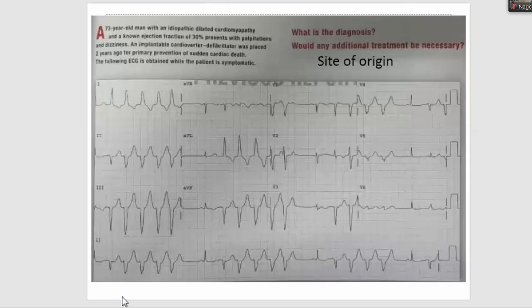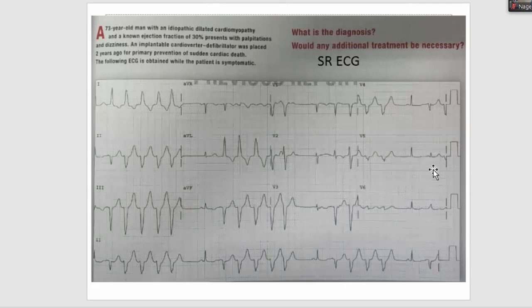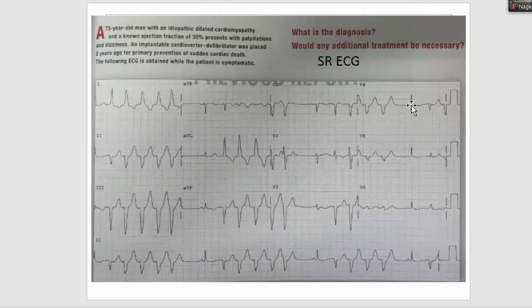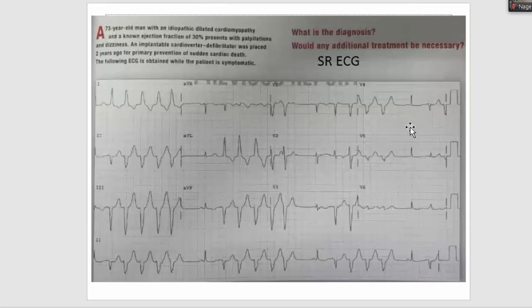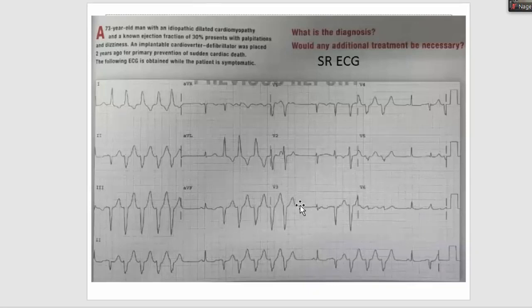We have identified the site of origin or exit of this VT. Looking at the sinus beats, there are low voltage complexes — never neglect this finding. Low voltage can occur in certain cardiac conditions, particularly amyloidosis. If it is TTR amyloid, there is now a good treatment available. If amyloid progresses to the end stage resembling restrictive cardiomyopathy, treatment options are limited, so early recognition is critical.